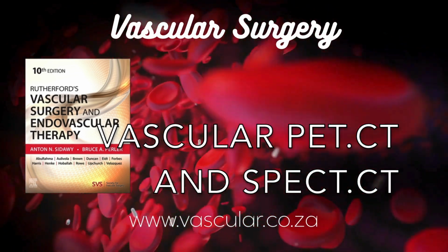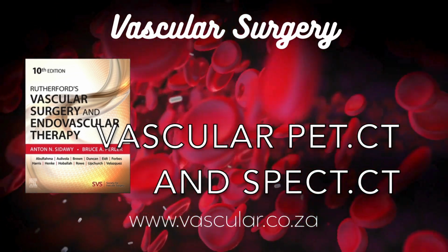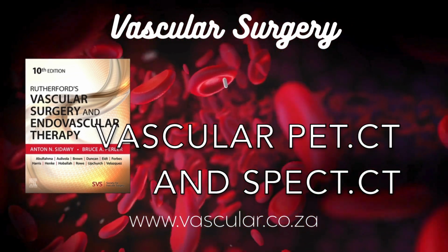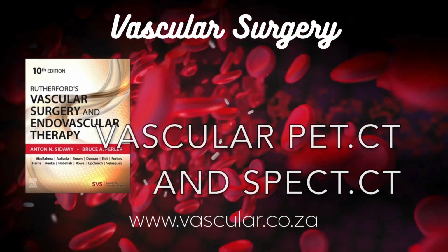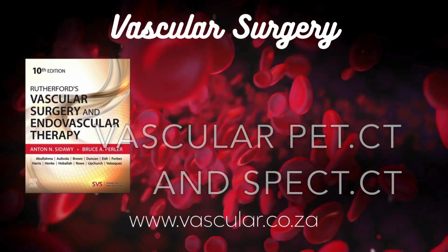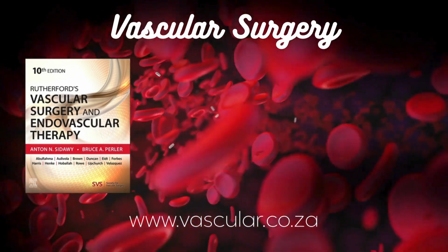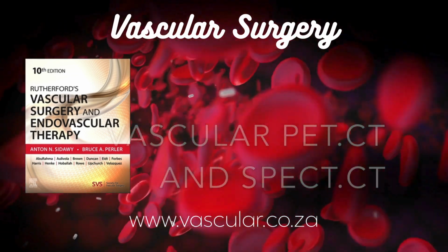So fusion is key. Studies show FDG-PET/CT has high accuracy for diagnosing graft infection when interpreted carefully, considering both the PET and CT findings. Comparing PET alone versus CT alone versus fused PET/CT, the fused images consistently perform best. Are there guidelines for imaging graft infections too?